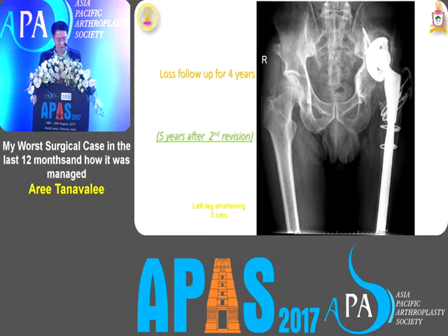At this juncture, if you look at this area, at that time we put in the jumbo cup, but the size of the cup was not well matched to the ML dimension, though it matched in the AP dimension. So this is part of hydroxyapatite.